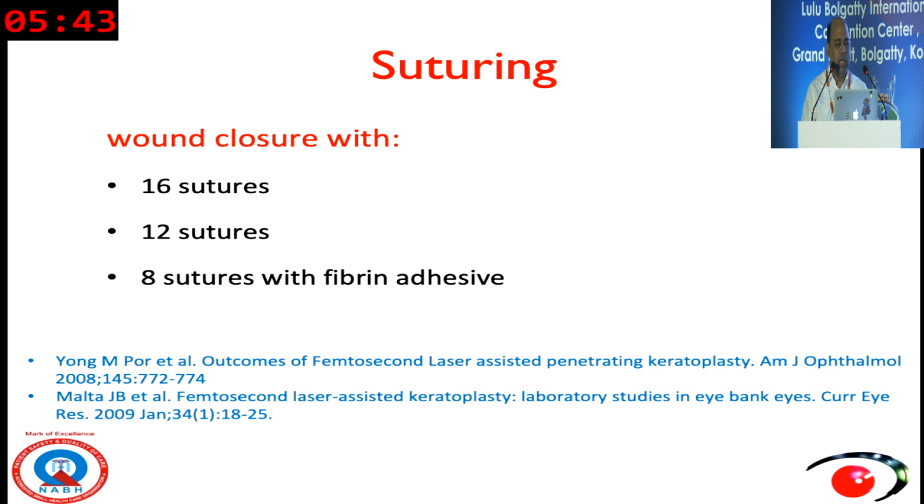Conventionally we do 16 sutures in most cases, but with the femtosecond laser, I prefer to do 12 sutures. Although I've tried 8 sutures with fibrin adhesive, I still recommend 12 sutures as sufficient with a femtosecond penetrating keratoplasty.